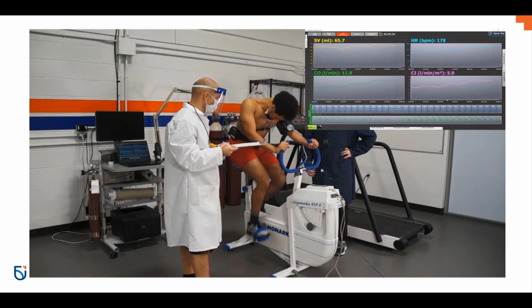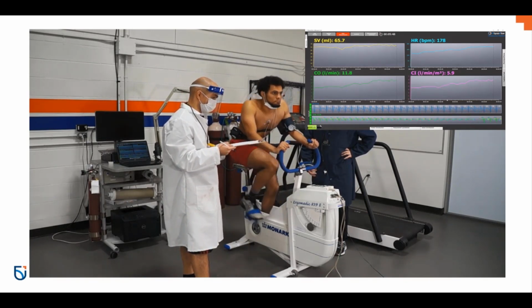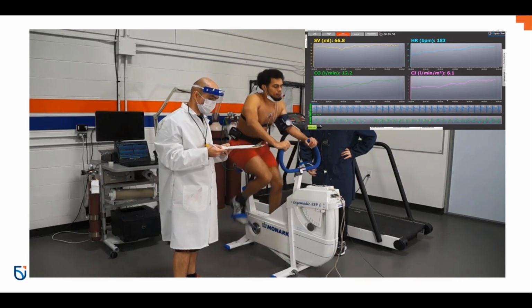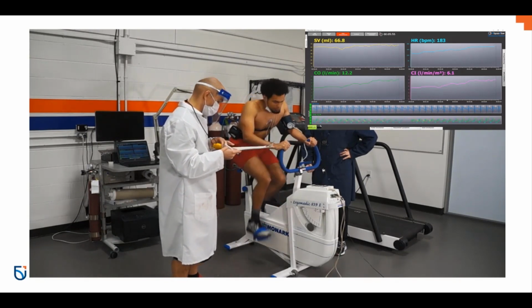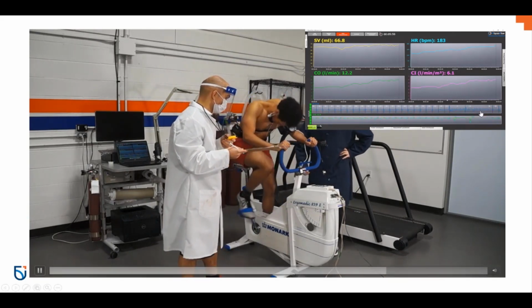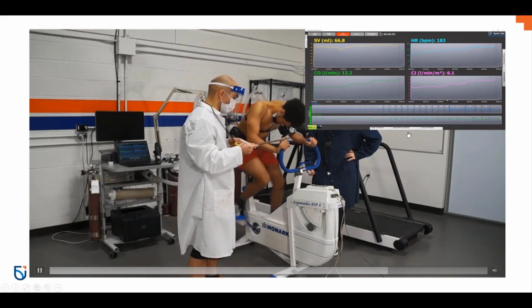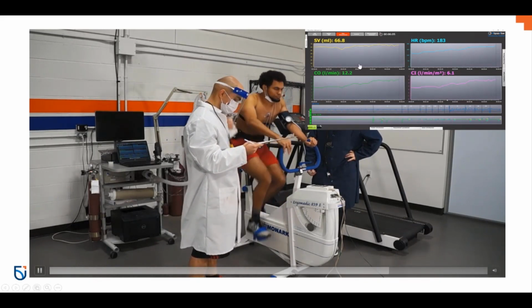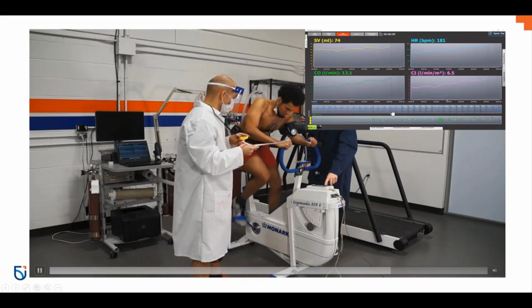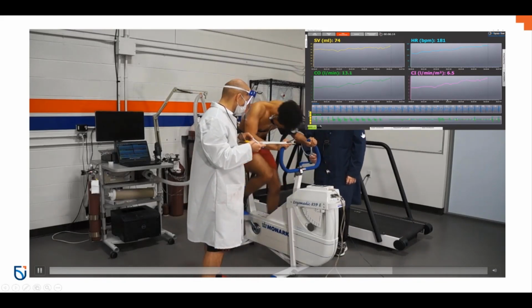I wanted to really show the distinction between heart rate ramping up fairly fast at the onset of exercise, and then stroke volume really taking over as the exercise gets very, very tough towards the end. You can see the signal's getting a little messy here as he starts moving. It's fairly good at detecting that, but we have to watch the signals constantly. If you start getting really messy signals like that and it doesn't return to a semi-normal looking baseline, you can get wonky measurements.